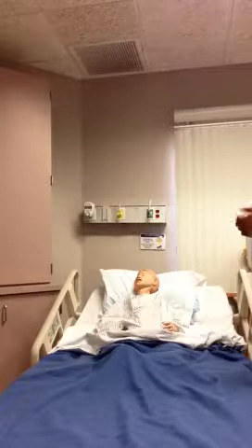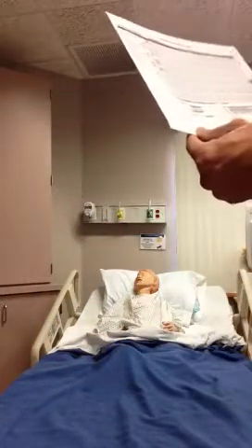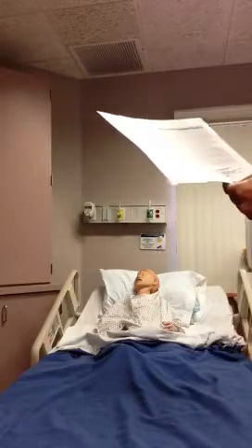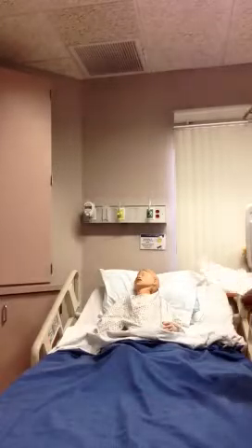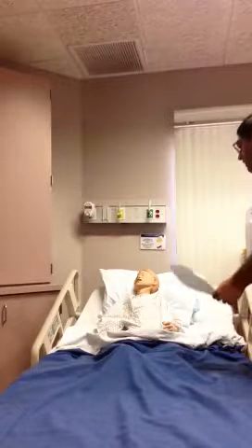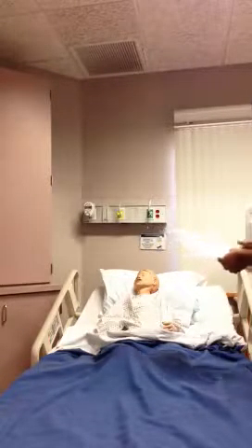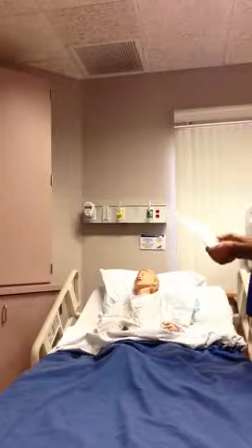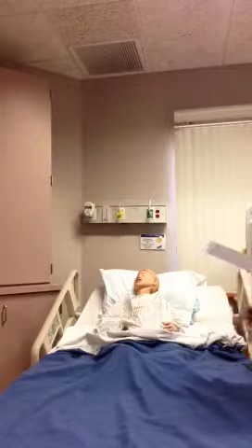I talk to my patient, introducing myself to my patient. In this case, my patient's name is Melanie Barnes, born 7/1977, but I'm going to ask her. Hello, what's your name and your date of birth? Okay, Melanie, that's what I have here. Yep, you were born 7/19/1977. Okay. So after introducing myself to my patient, I'm going to explain what we're going to do.